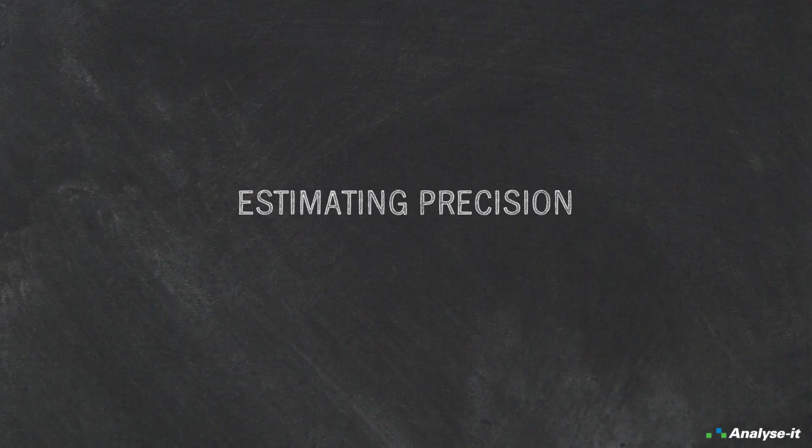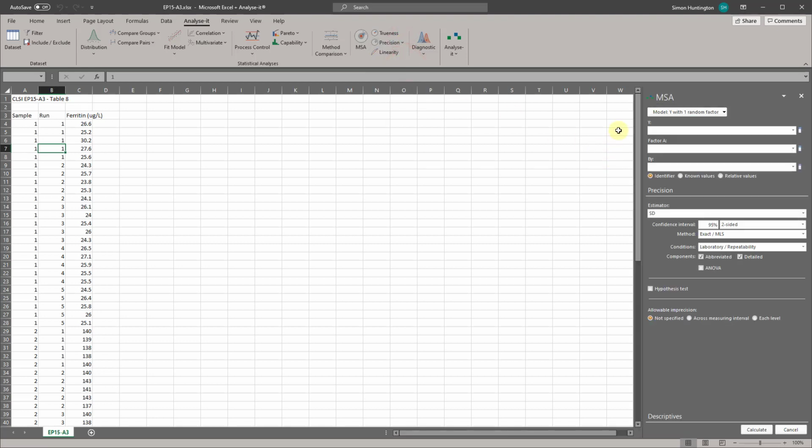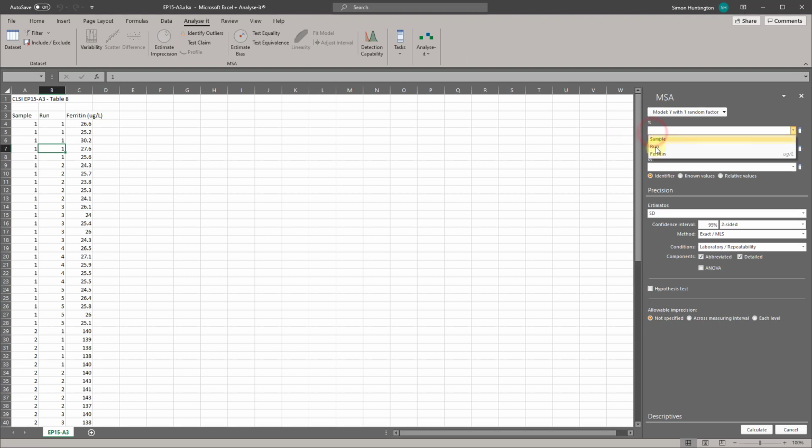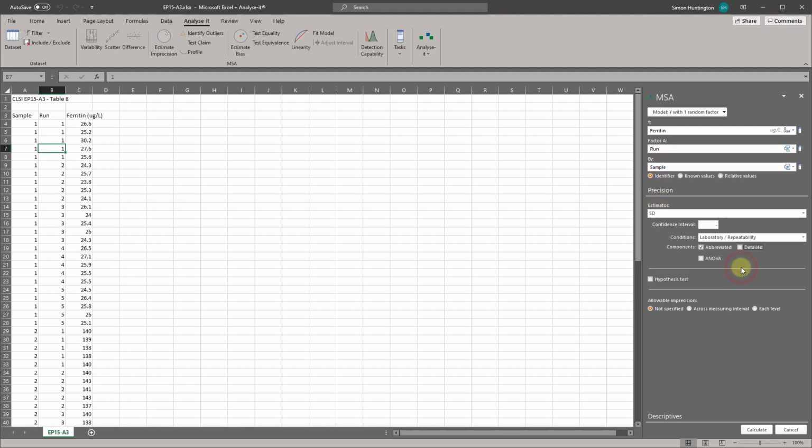Estimating precision. To estimate the precision of the measurement procedure, click a cell in the dataset. On the Analyse-it ribbon tab in the Statistical Analysis group, click Precision and then click One Factor. The Analysis task pane opens on the right. In the Y drop-down list, select Ferritin. In the Factor A drop-down list, select Run. In the By drop-down list, select Sample. Then clear the Detailed Components checkbox.